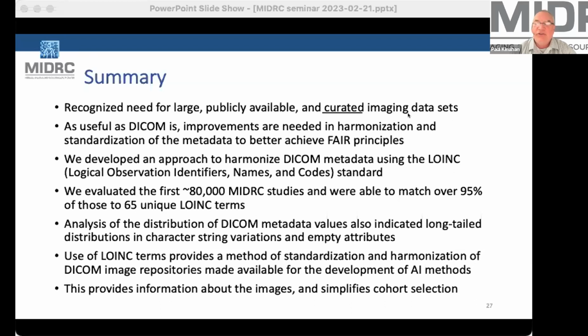In addition to the two main tables, which I forgot to mention, by the way, are on GitHub. And the process, it was in that table, I think, that I went through a little quickly. The abstracted information about the CT data or the modality and site description is uploaded by RSNA and ACR to GitHub.